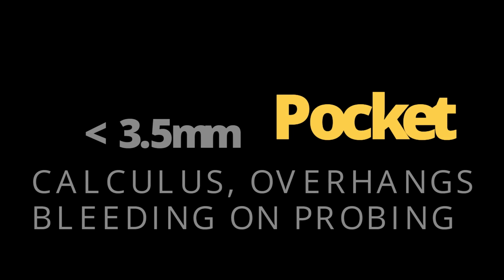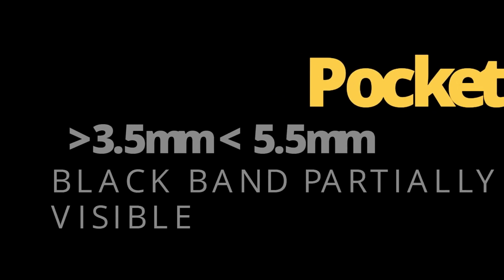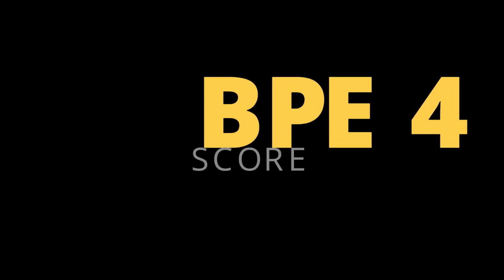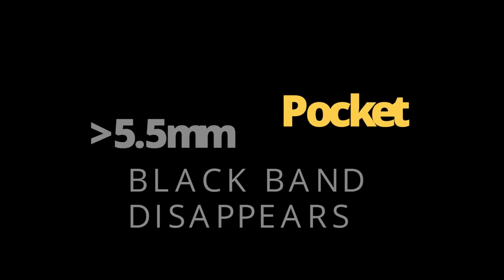A BPE of 3. This is where the probing depth is between 3.5 and 5.5 millimeters. The black band is partially visible, indicating a pocket of between 4 and 5 millimeters. BPE of 4. This is where the probing depth is greater than 5.5 millimeters. The black band disappears, indicating a pocket of more than 6 millimeters. And an asterisk. This is where there is a furcation involvement, and this can be applied to any of the other BPE scores.